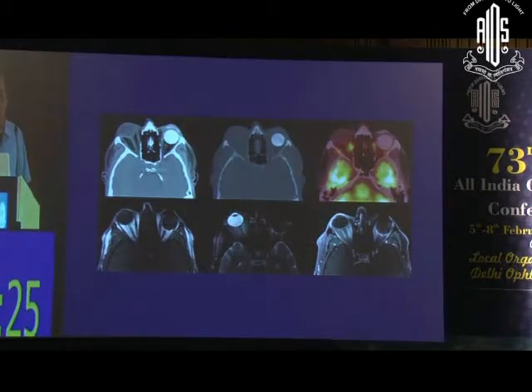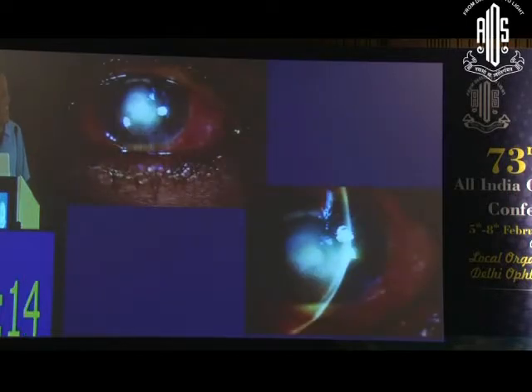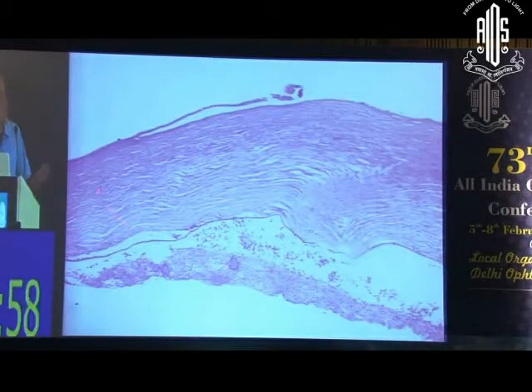What is this? Cakewalk. No pathology in it. It's an implant. Okay, now this was a patient who came with redness, diminution of vision, watering, etc. Differential diagnosis? Okay, fungal ulcer. Anything else? Okay, that's how the biopsy looked like.